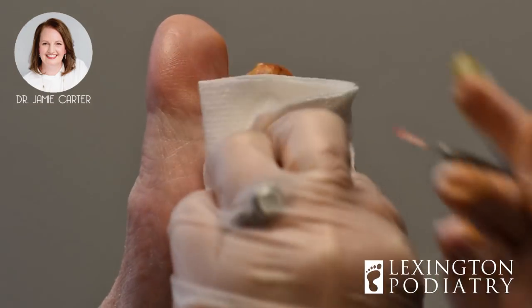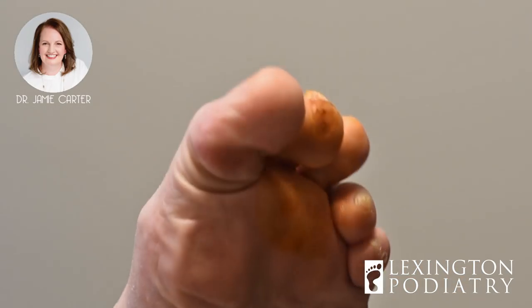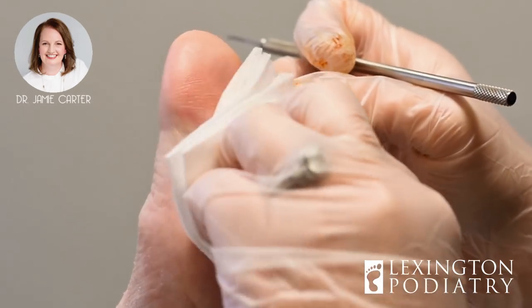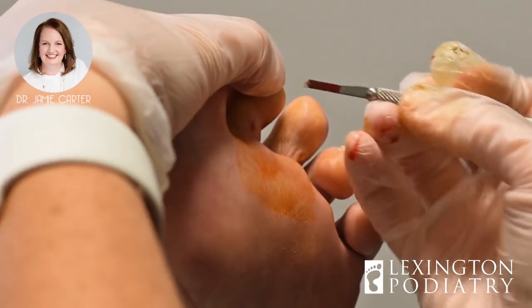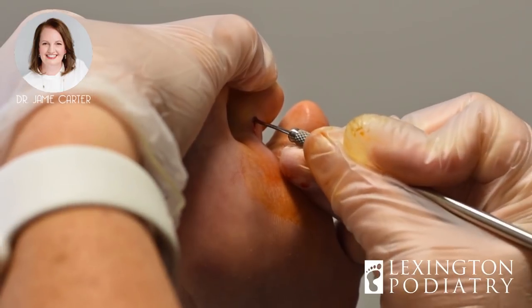That did amazing. So of course the toe is still going to be bent — can you bend them down for me, my dear? Good. It doesn't grip any harder than it has to. I will also bandage it so I try to lift up on this part so that we can get as much correction as possible.